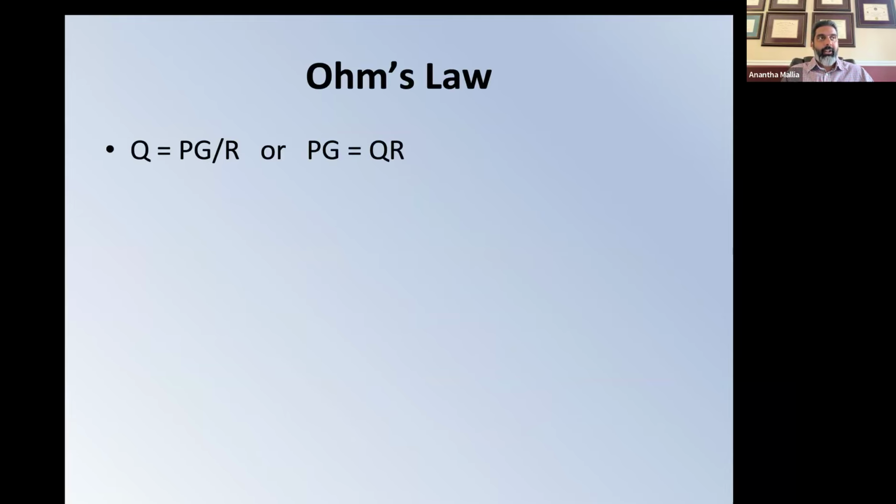The evaluation for aortic stenosis, just like a lot of echocardiography and a lot of cardiac physiology and respiratory physiology and critical care as a whole, relies on the understanding and the application of Ohm's law. Now, as you guys have already learned many times over, Ohm's law describes the fluid dynamics relationship between flow, pressure gradient, and resistance.